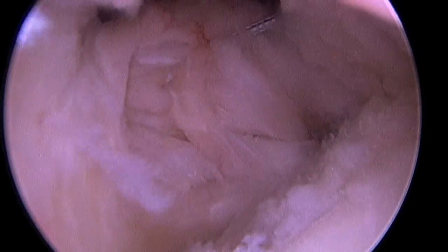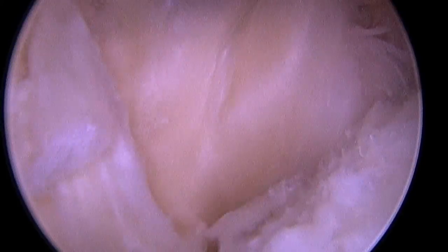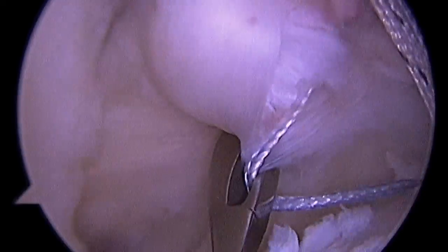Here in contrast is a tear of the subscapularis tendon. You can see as I pull on it with a traction stitch, it moves independently of the humeral head. And so what we're going to do is repair that.